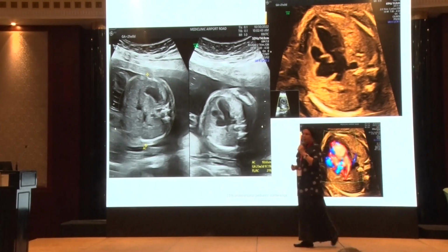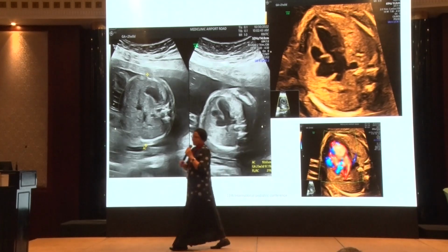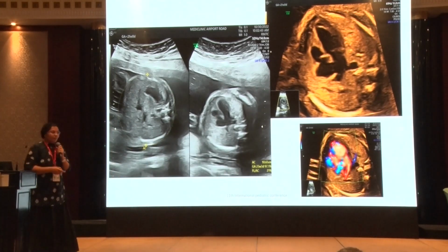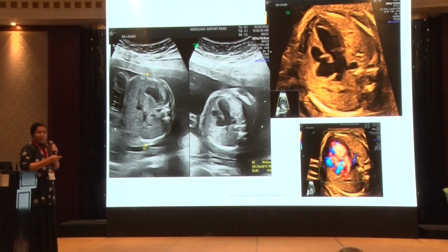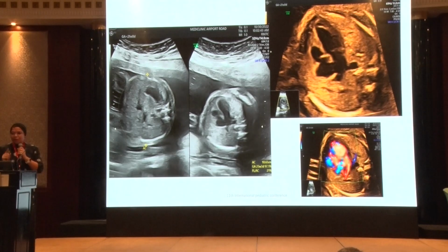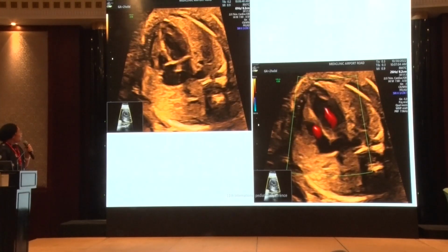This tip actually I learned from Dr. Suleiman when we were doing fetal echo together in Tawam Hospital, and it was mentioned by Dr. Diana today: we have to show the pulmonary vein in both 2D as well as color. And Dr. Suleiman will be even more strict with me, put the pulse wave to show that it's really a vein and not the artery. Isn't it, Dr. Suleiman?